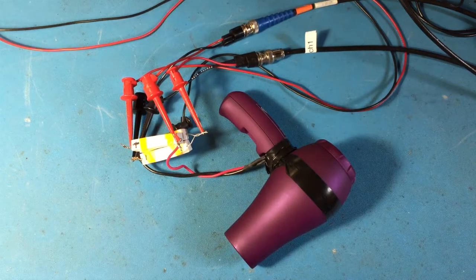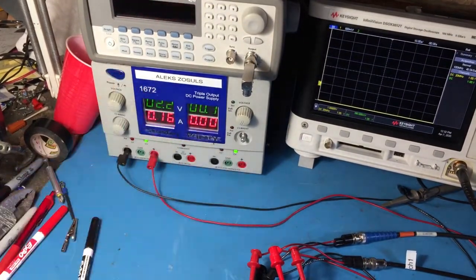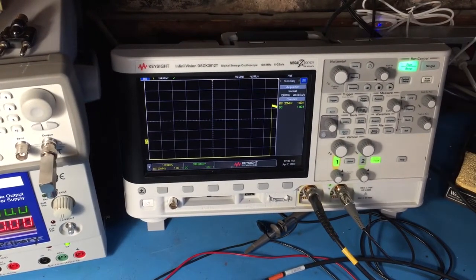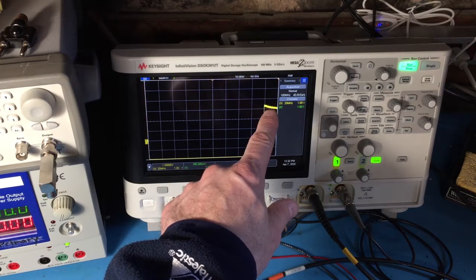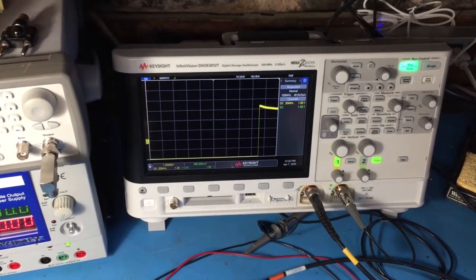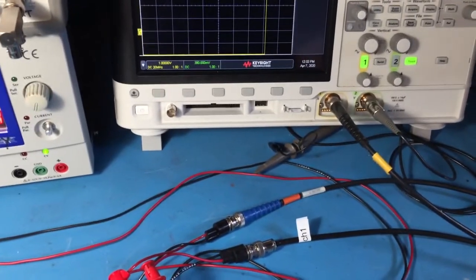Now we're going to turn this thing on, go over to our power supply, fire it up, then we can go to our oscilloscope, see what's happening. So notice the oscilloscope was saturated negative and it jumped up, and now it's starting to come down. See, the signal is slowly decaying down. It might be something familiar we've seen before, maybe in the RC time constant lab perhaps.